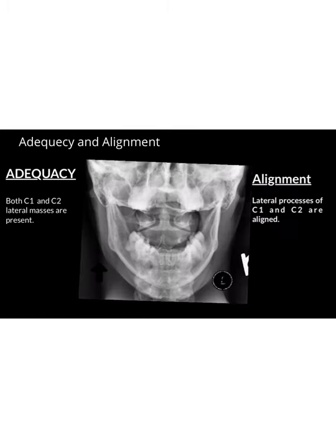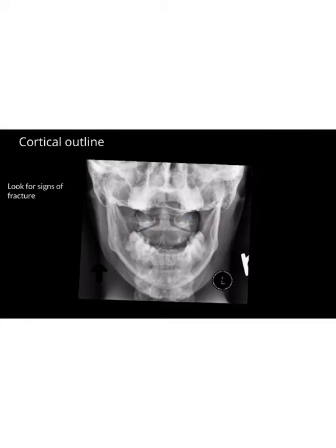Adequacy, alignment, and cortical outline are the most important aspects of the odontoid view x-ray. Adequacy dictates that both C1 and C2 lateral masses are present — here are the C1 and C2 lateral masses. Alignment dictates that the lateral processes of both C1 and C2 are aligned on both sides, and we can see they are perfectly aligned here. For cortical outline, we look for any fractures, which is not the case in this example.